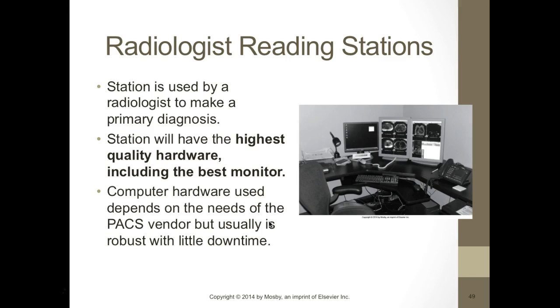So the radiologist reading stations, so they're used by the radiologist for reading the films. So the stations have the highest quality hardware, including the best monitors. So they're looking at the images in high speed. They'll scroll through, which we'll talk about here pretty quick.